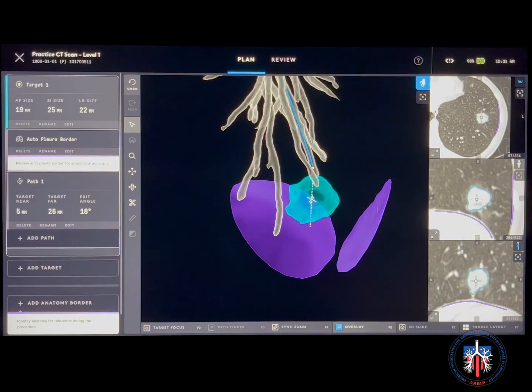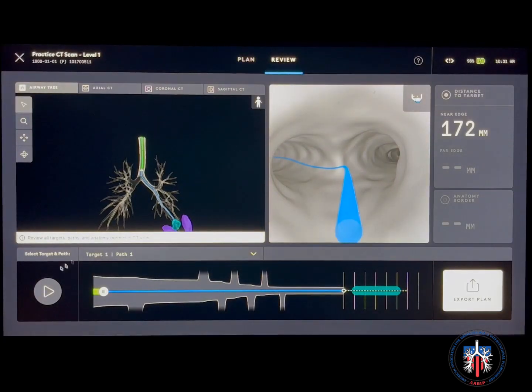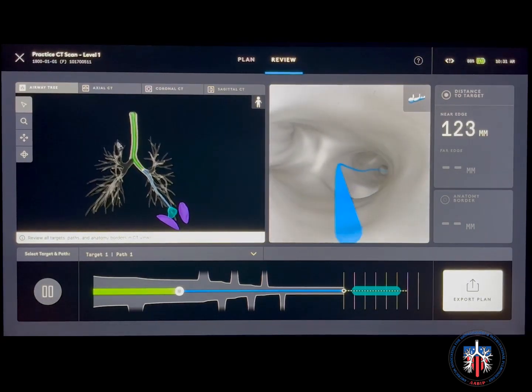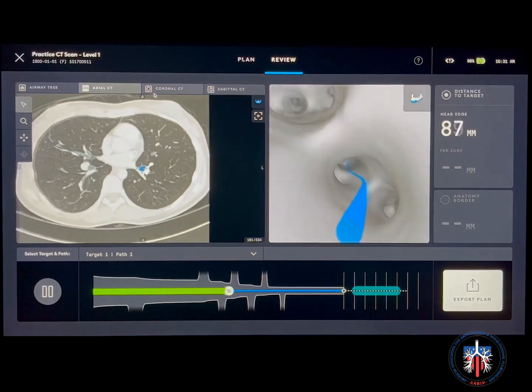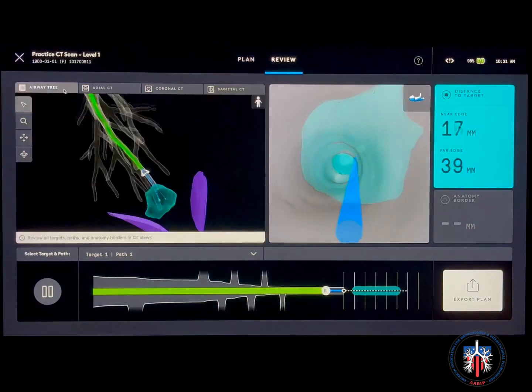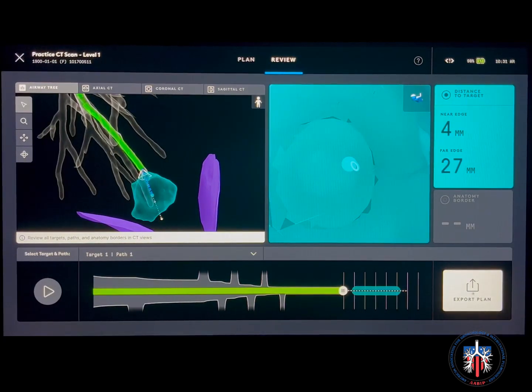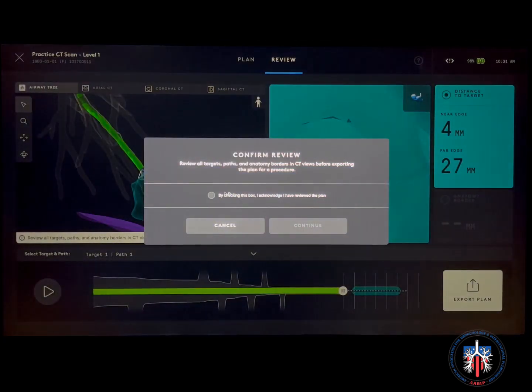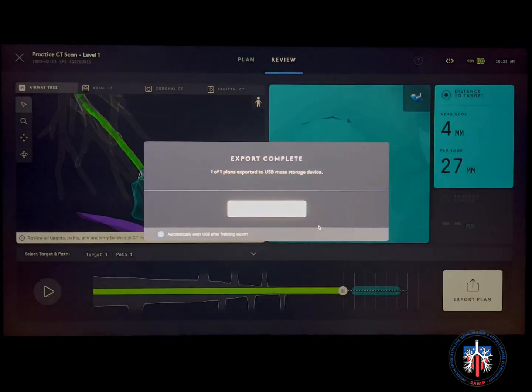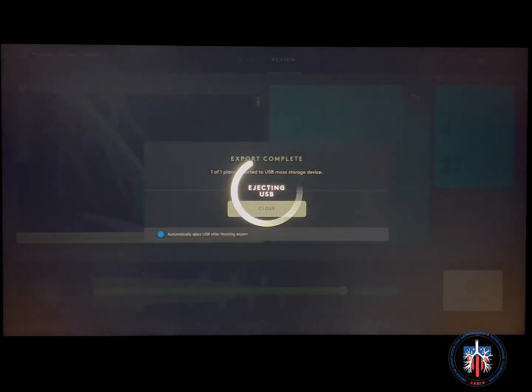Next, click review to review your path. Click play to review the virtual path on the 3D airway tree as well as in each of the axial, coronal, and sagittal views. At this point you can create additional paths, or if satisfied, you can click export plan to export the plan to a USB flash drive that can then be inserted into the ION controller to allow the plan pathway to be used during the case.